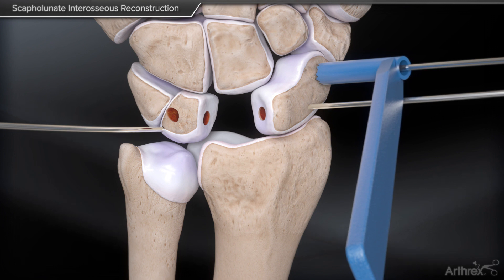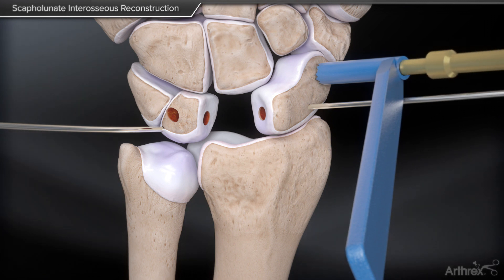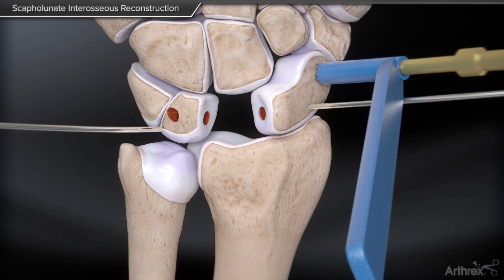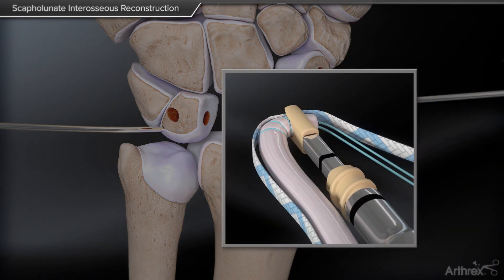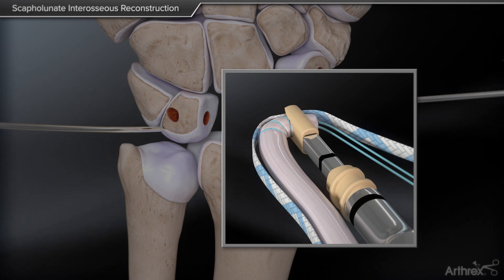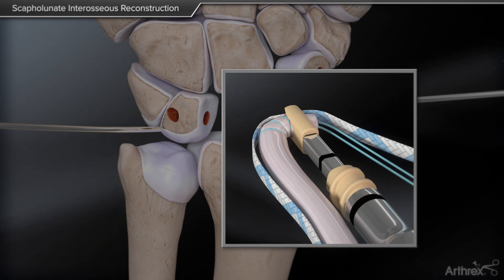The final drill tunnel is placed into the distal pole of the scaphoid. The tendon graft and suture tape construct is then loaded onto the DX swivel lock and inserted into the scaphoid.